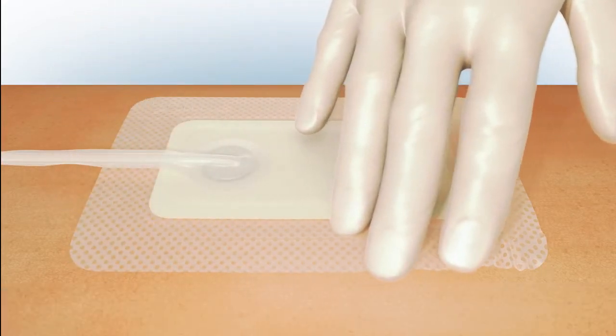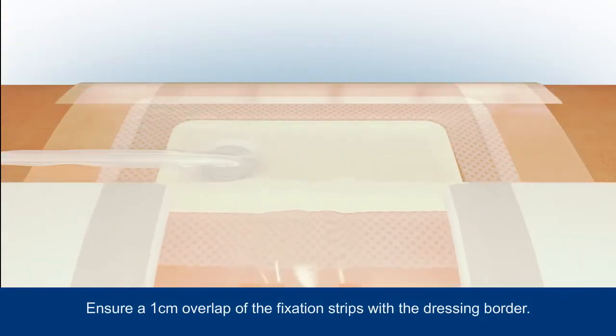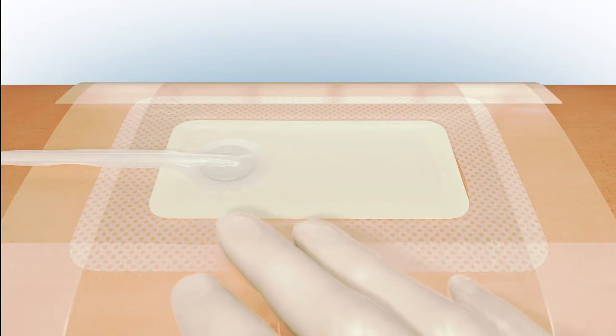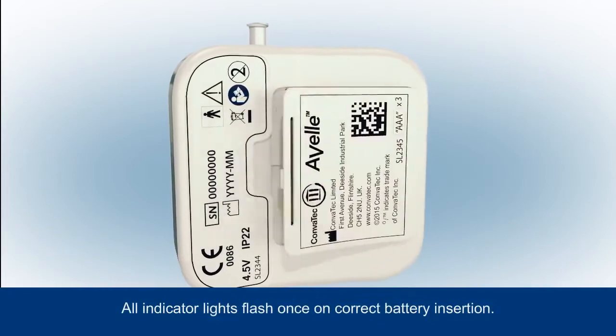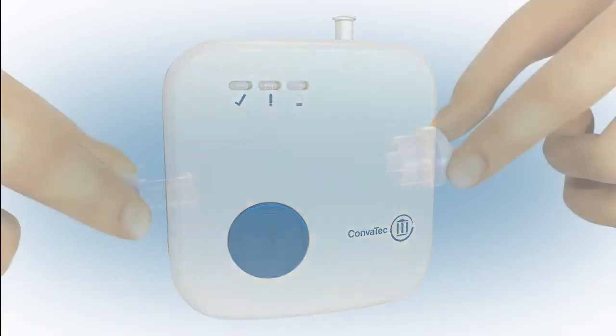To maintain a good seal during the wear time of the dressing, apply the fixation strips with a one centimeter overlap to each side of the dressing. Smooth the strips to ensure an effective seal, being sure not to trap the tubing. Place the batteries as indicated in the battery compartment; all indicator lights will flash once.